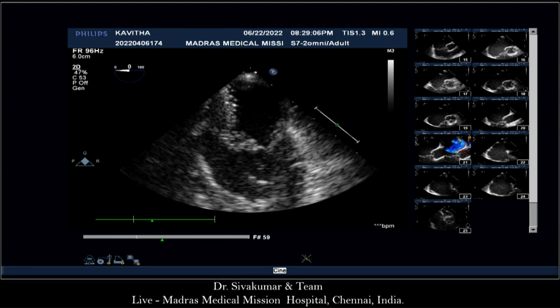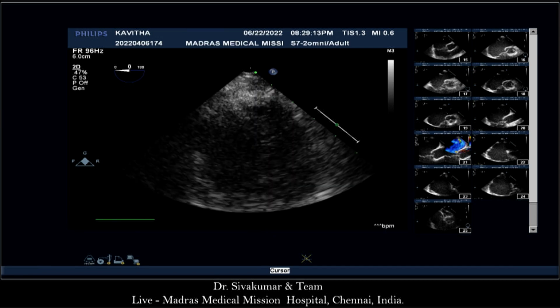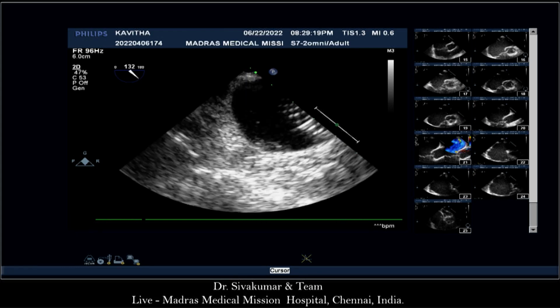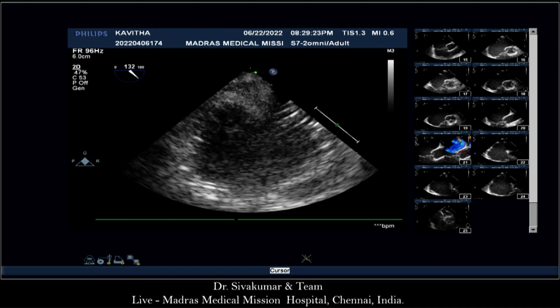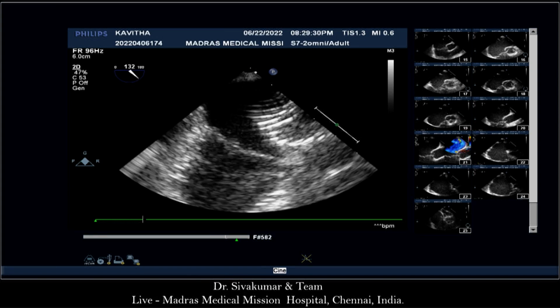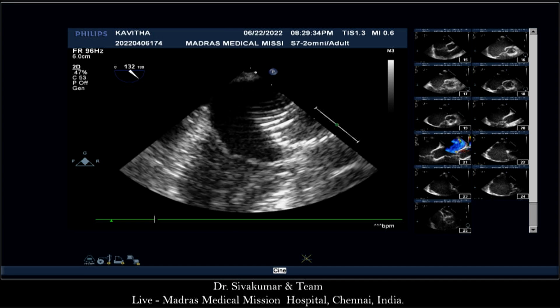See that mitral valve? I think the problem with all these mitral valve things is that the device is always in front of the valve. I think you should have a transthoracic view as well, because then you have the valve in front of the device, and that perhaps might clarify the situation a little bit better. Whichever it works, we need to look at the mitral valve because it's a pretty large device. Can you see it, Zahid, now? 6 by 28 by 31.